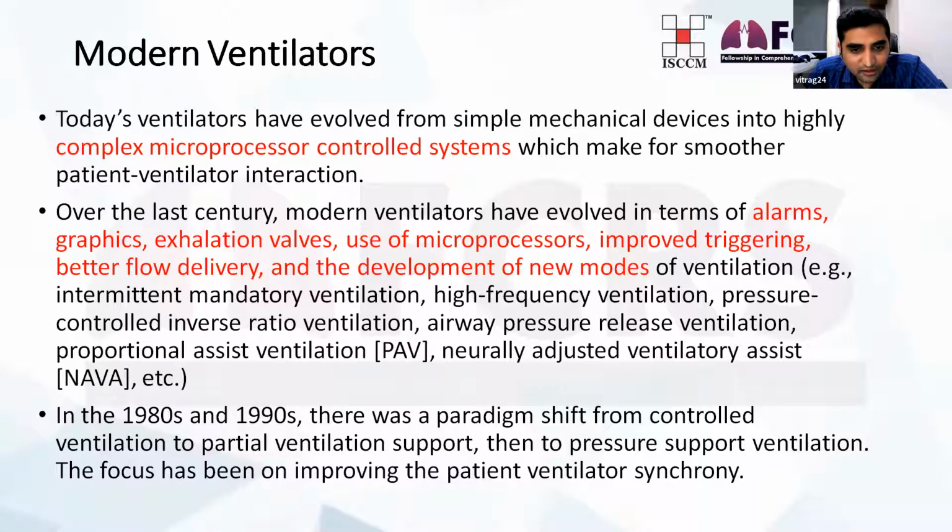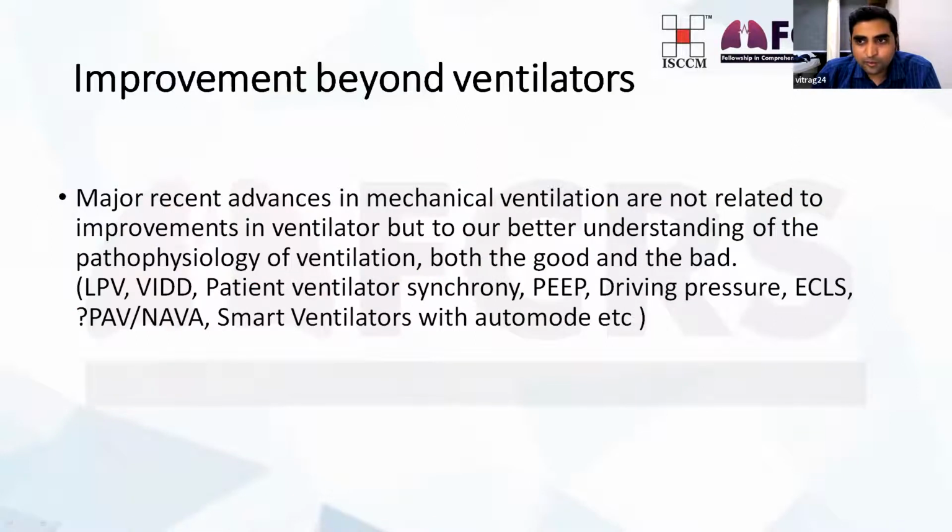So in 1980 and 1990, there was a paradigm shift from controlled ventilation to partial ventilation and then to pressure support ventilation. So the focus has been on improvement of patient-ventilator synchrony. The improvement beyond the ventilator occurs not in the machine itself, but in our understanding of the pathophysiology of ventilation, both the good as well as the bad.